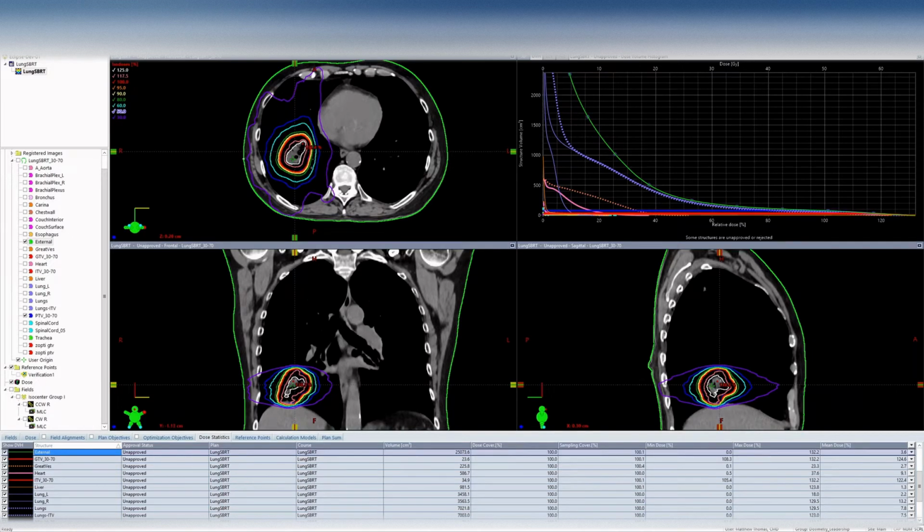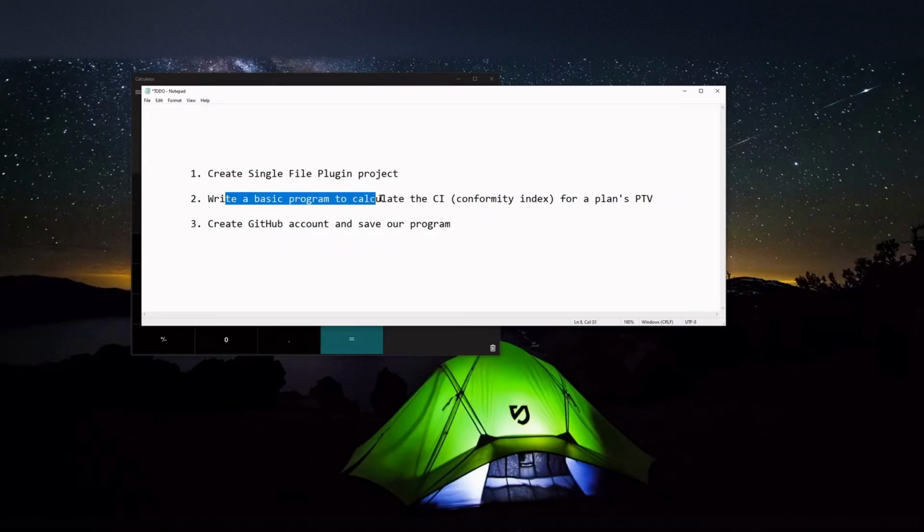So we've got that context. And so what we're going to do is create a single file plugin project. We're just going to make this as simple as we can to start, and then we will build from there.